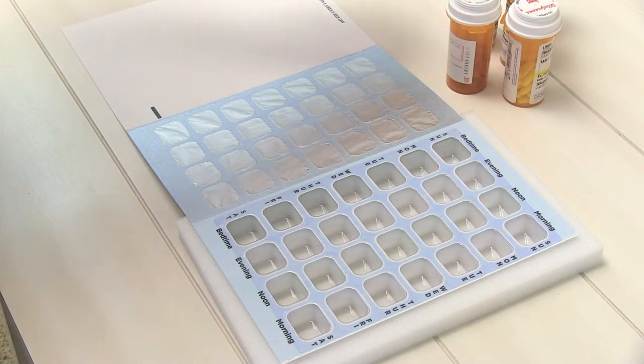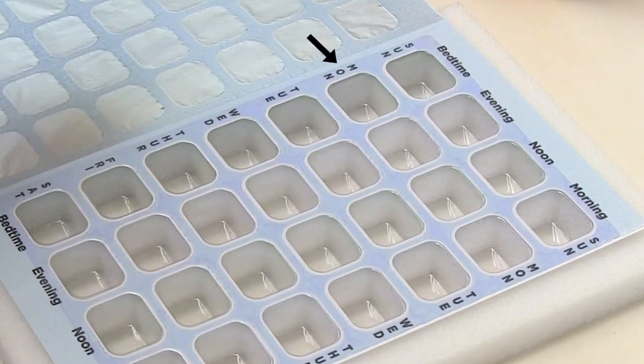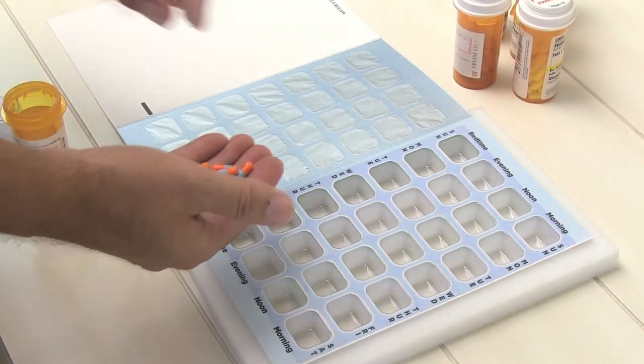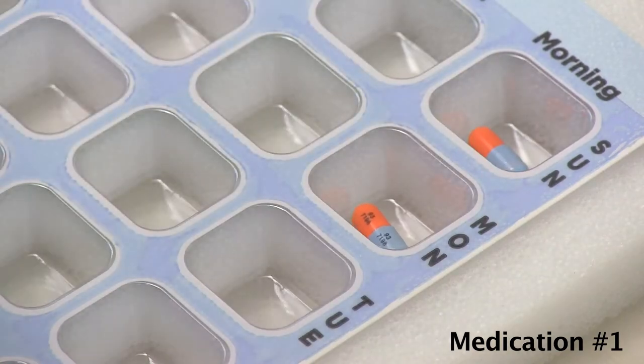Next, let's fill our medications. You'll notice that the printed days of the week and times of the day correspond with the same information printed on the front of the card. This makes it quick and easy when filling the card. Our first medication is taken twice a day, in the morning and in the evening.